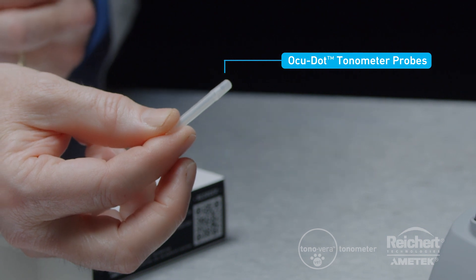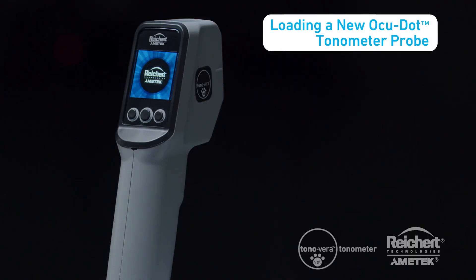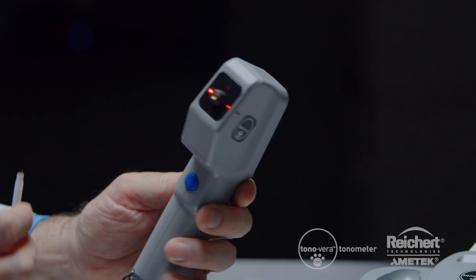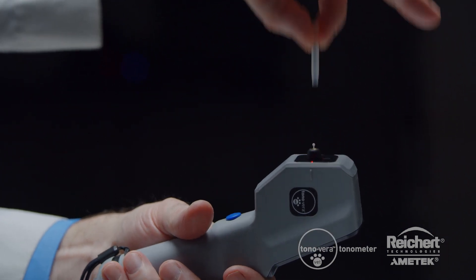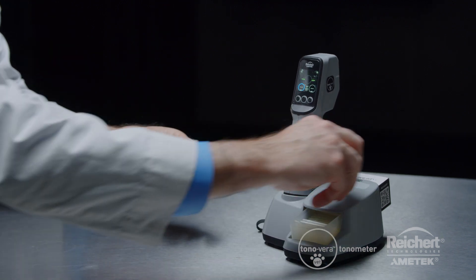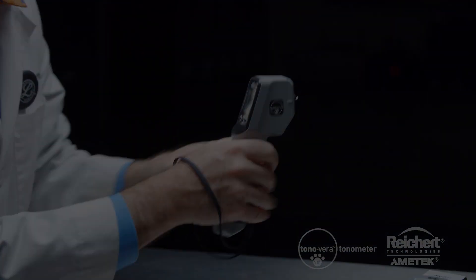Ocu-Dot tonometer probes are single-use and sanitized to prevent the risk of cross-contamination. Loading a new Ocu-Dot probe is easy. Power on the Tono-Vera Vet — the screen will then prompt you to load a new Ocu-Dot probe. Remove the cap from the Ocu-Dot probe tube and insert the end of the tube into the chamber. Rotate the unit up so that the Ocu-Dot probe slides into place. Conveniently store the probe tube in the base recess while you're taking a measurement.